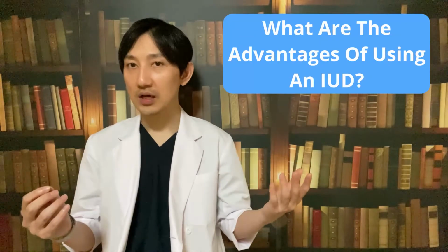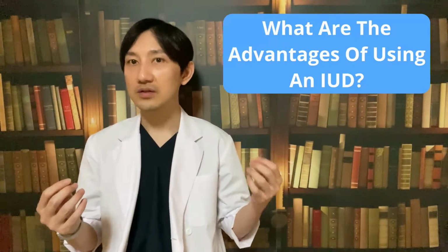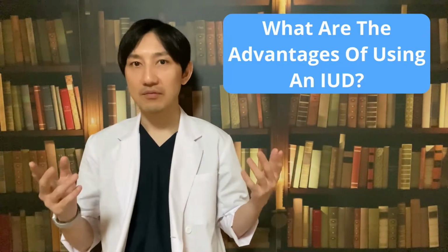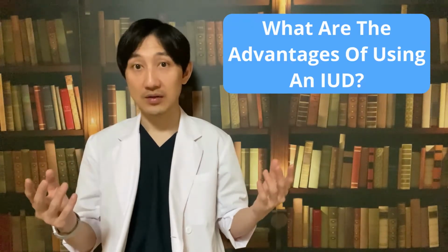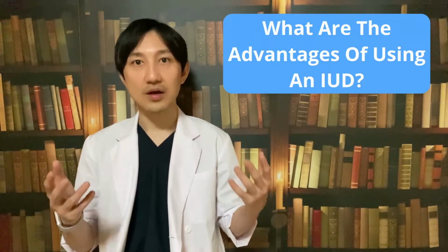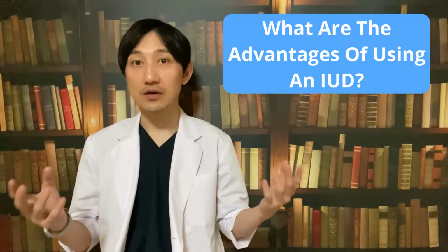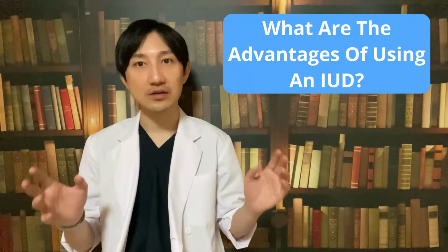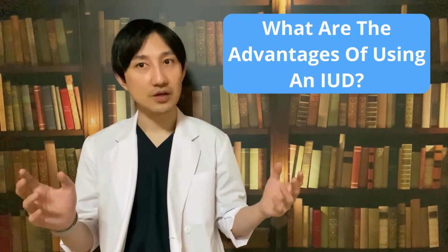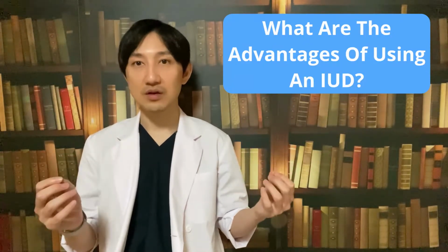Okay then, what are the advantages of using an IUD? There are several advantages, but the big one is that you don't have to think about it before or during sex, like you do with condoms or the cap. It also gives long-term protection, either 5 or 10 years, depending on the type you have fitted, and it starts to be effective as soon as it is inside you, so you don't have to wait. It doesn't have any hormonal side effects, like headaches, aching breasts, or skin problems that you can get with some other methods of contraception, and you can also safely take other medicines while you are using a coil. It has no effect on your weight, and it doesn't put you at increased risk of cancers of the cervix, uterus, or ovaries. Lastly, as soon as you have it taken out, you can get pregnant again.